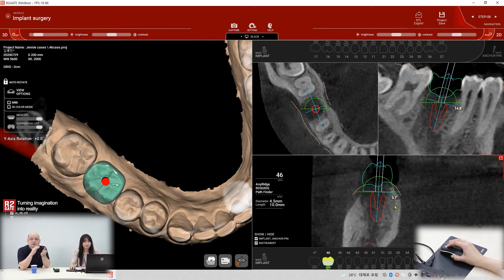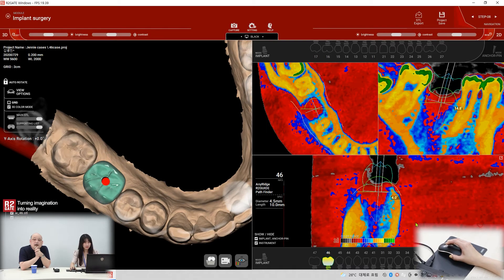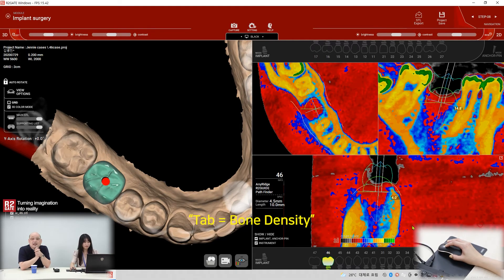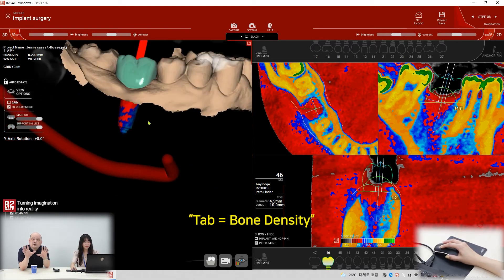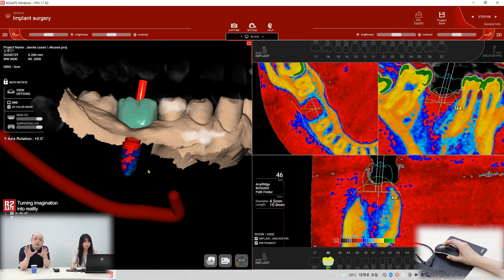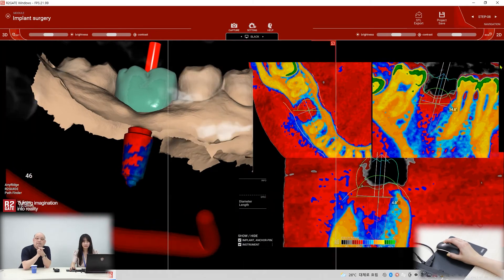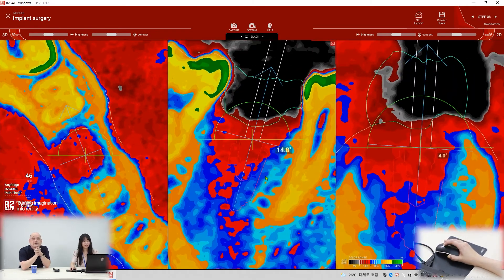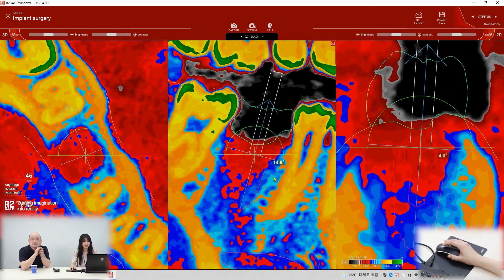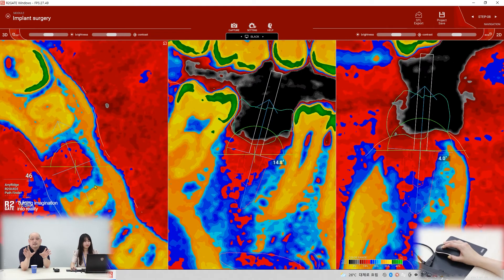Can you show me the bone density also? Which key is it? Tab. Tab is bone density. Show me the big screen. Can you see? That's the bone density.